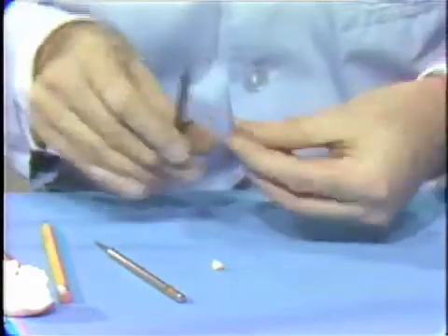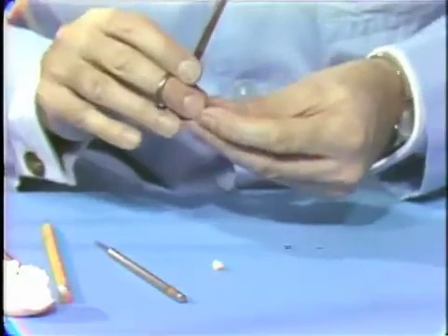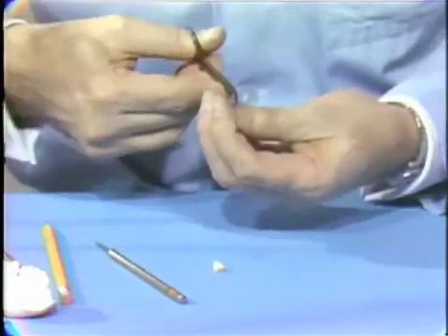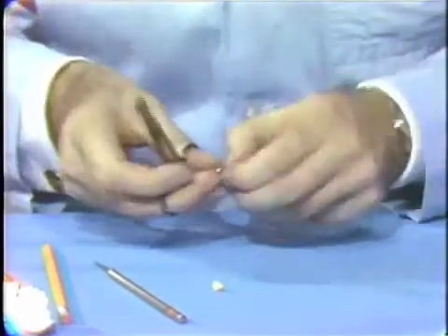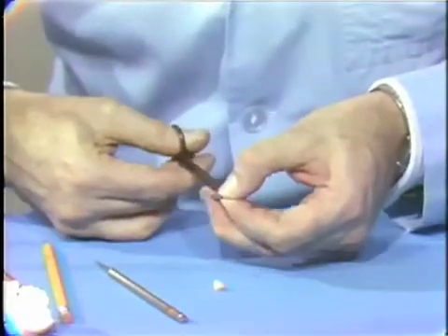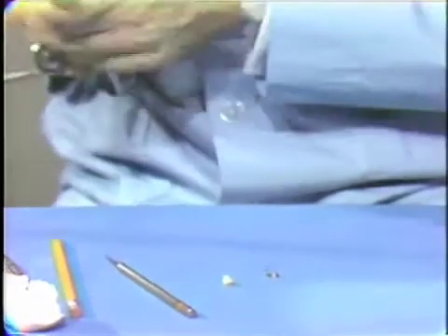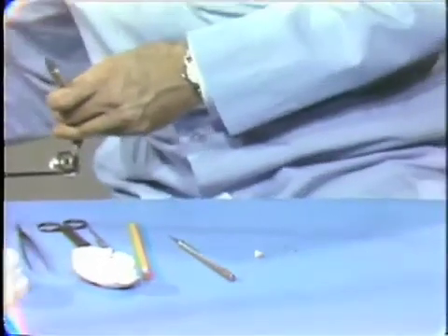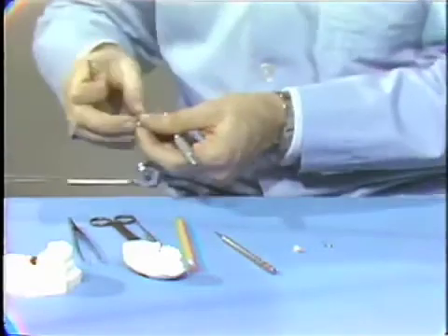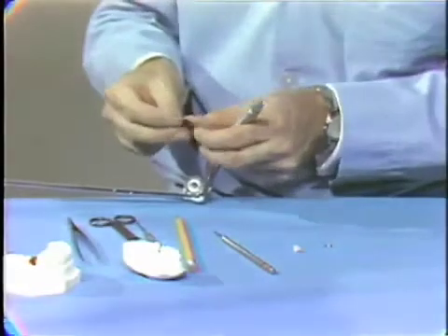The bend in the middle of the backing makes this rather a difficult procedure. You want a very sharp pair of crown shears that will cut right down to the very tip, and if you don't have that, you may find it not work out too well. Sometimes it's convenient just to put a little cut in this area up to that point, and if you can't do that with the tips of your crown shears, then it's a good thing to take a Joe Dandy disc and to use that just to make a little cut in at the situation of the angle of the backing.